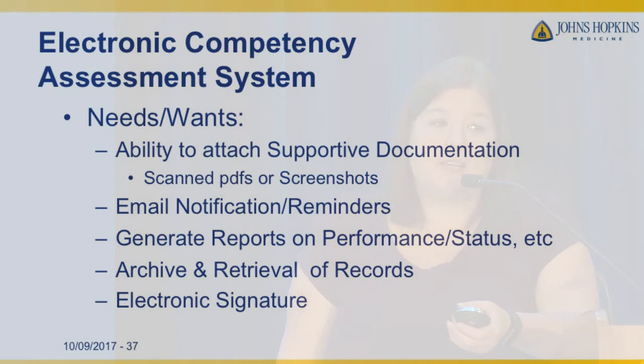And electronic signature. You have to have your assessments signed. They have to sign them. So obviously printing them out and signing them is not really helpful. But having an electronic signature, we do it for everything else. Why can't it be included in this as well? And like I said, it keeps going.